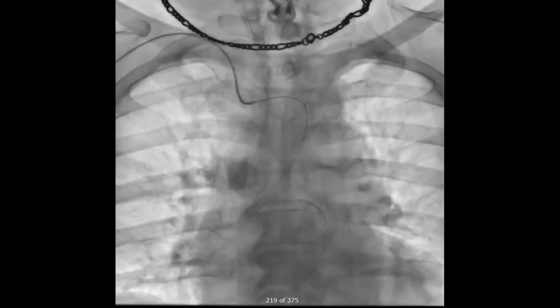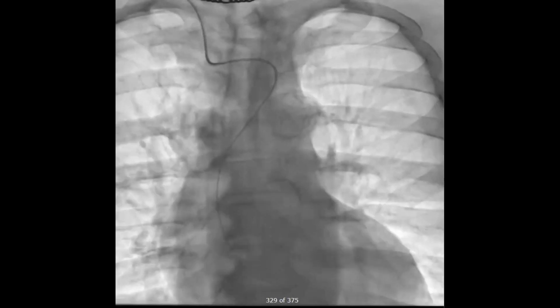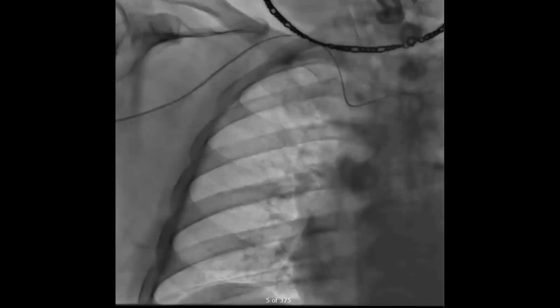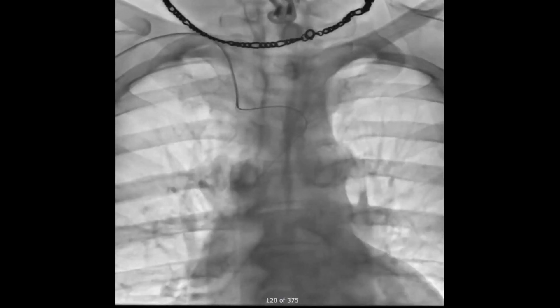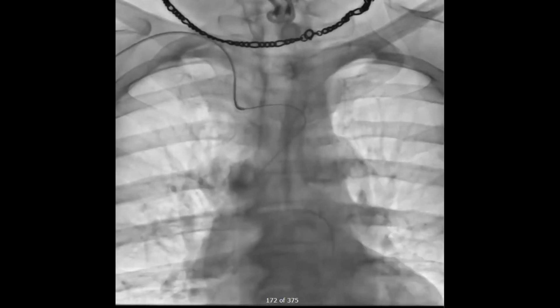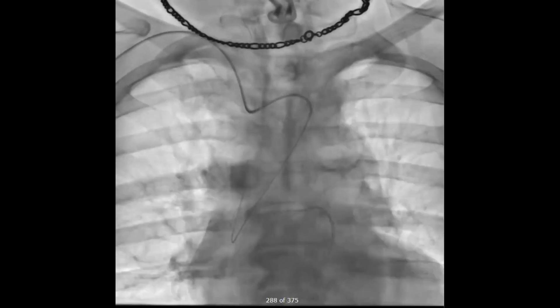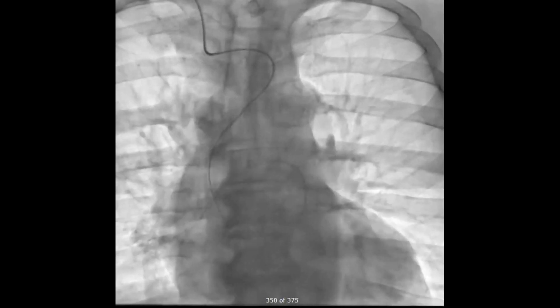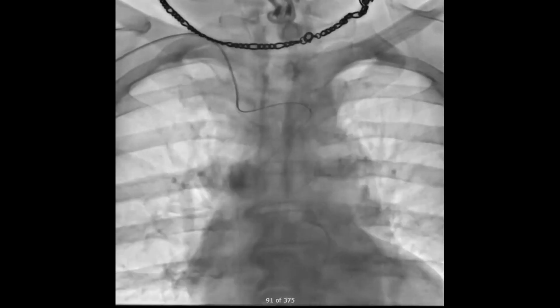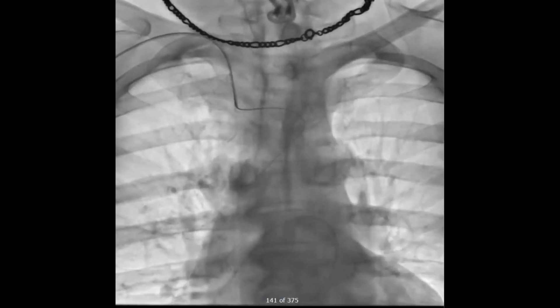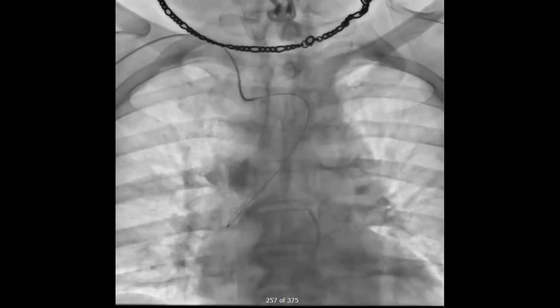Although we were able to get it down by manipulating the catheter. As you can see in the subclavian and innominate artery, there's a bend, and that bend can straighten up with deep inspiration or clocking the catheter. We were able to get it down with that maneuver, but the further maneuverability of the catheter is significantly affected. I would caution you not to manipulate this arch a lot, because if it gets dissected, it can go into the carotid — it's an emergency. If it doesn't straighten up with the J-wire, I do not put Amplatz or Lunderquist wires. I've seen that happen to a colleague, and I've stopped doing that since. That means open surgery right away — the surgeons need to be called.